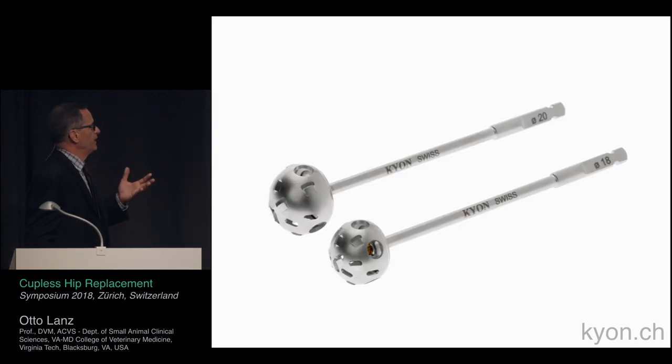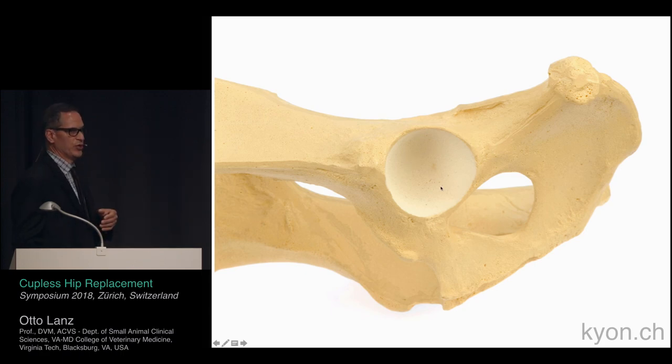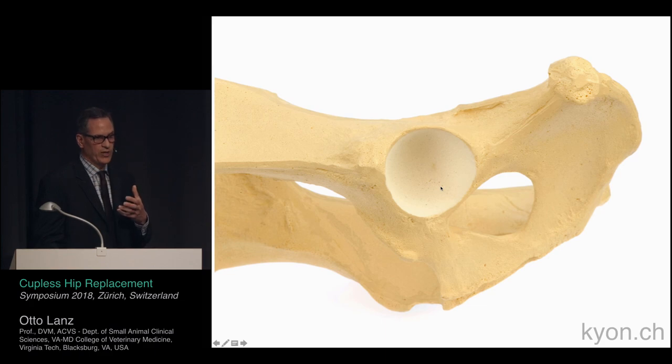For the mini size, there is an 18 and a 20 that can also be used. In this model, you can see that we ream just a little bit past the cancellous bone — so we ream just slightly deeper with this system.